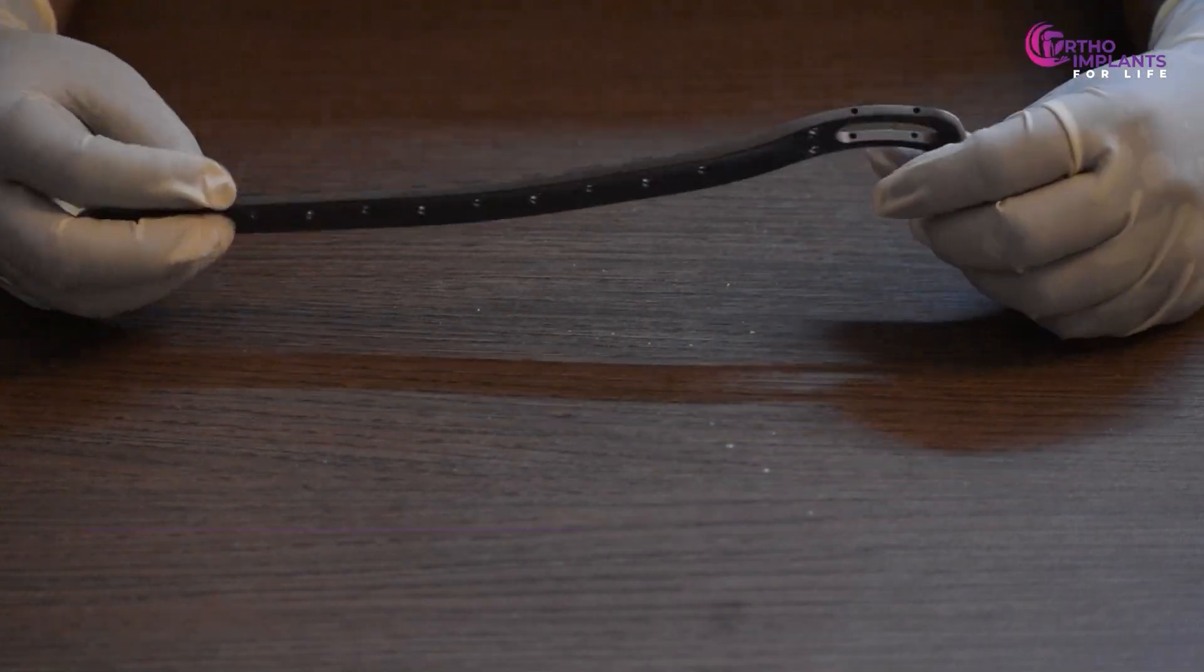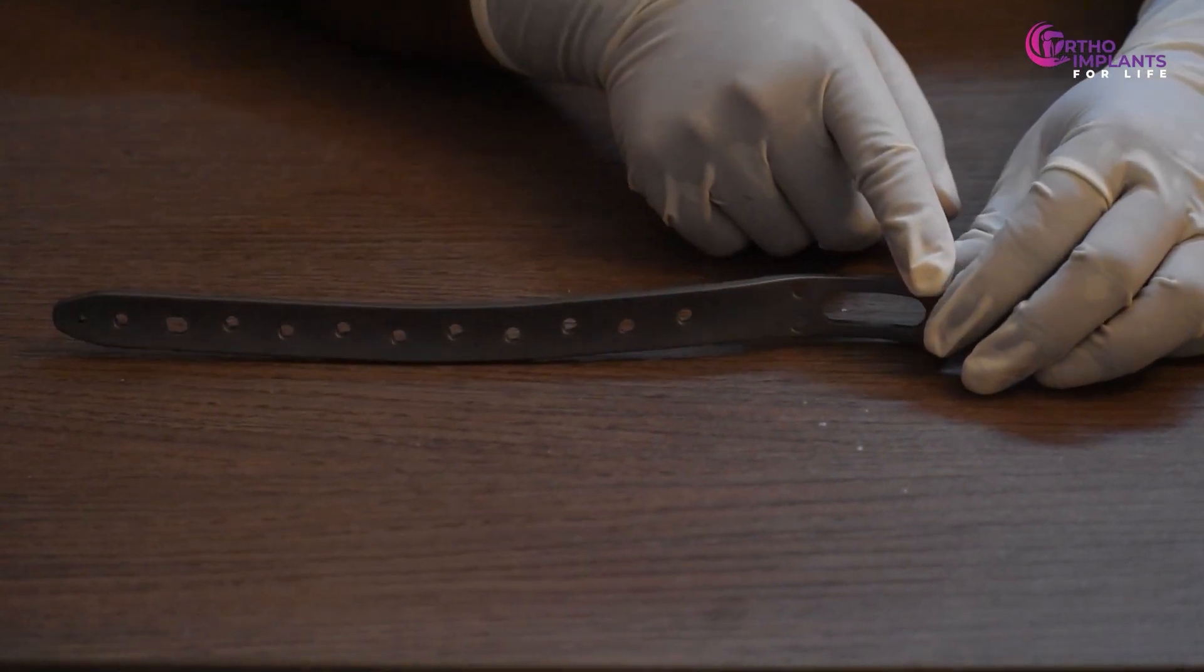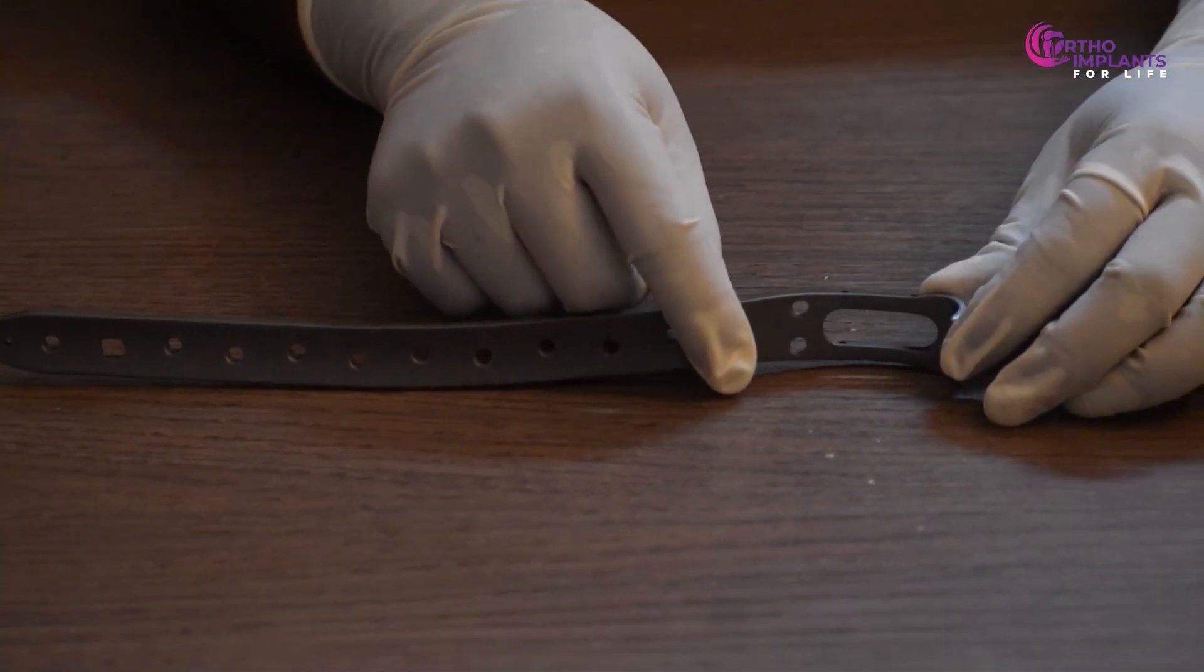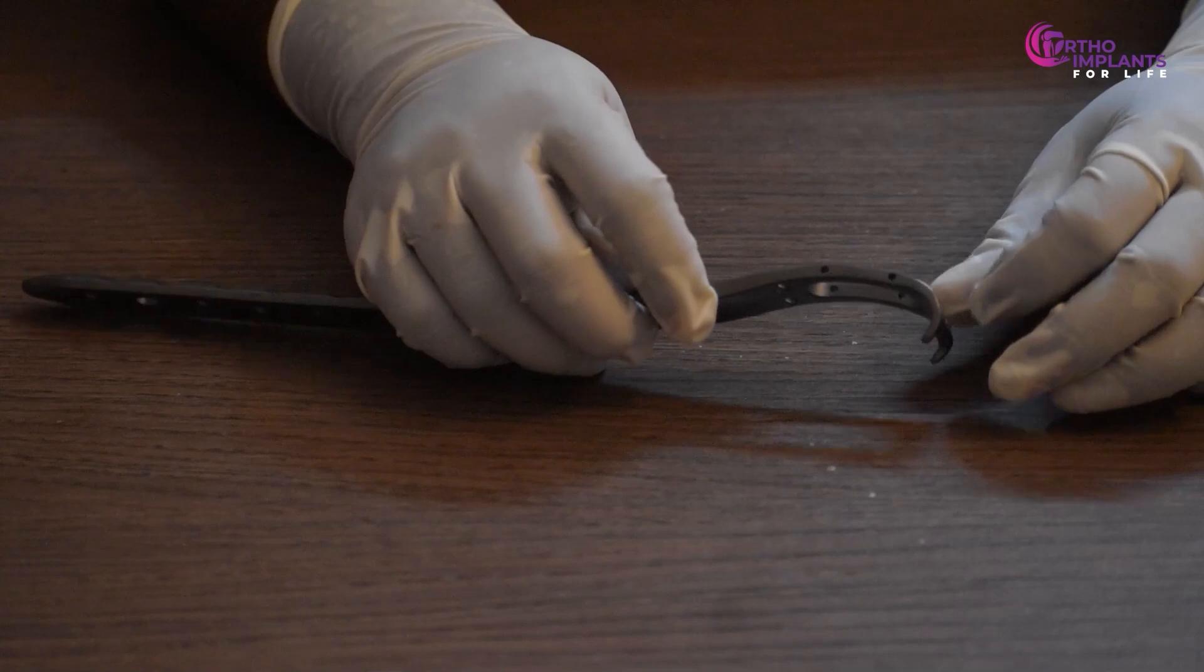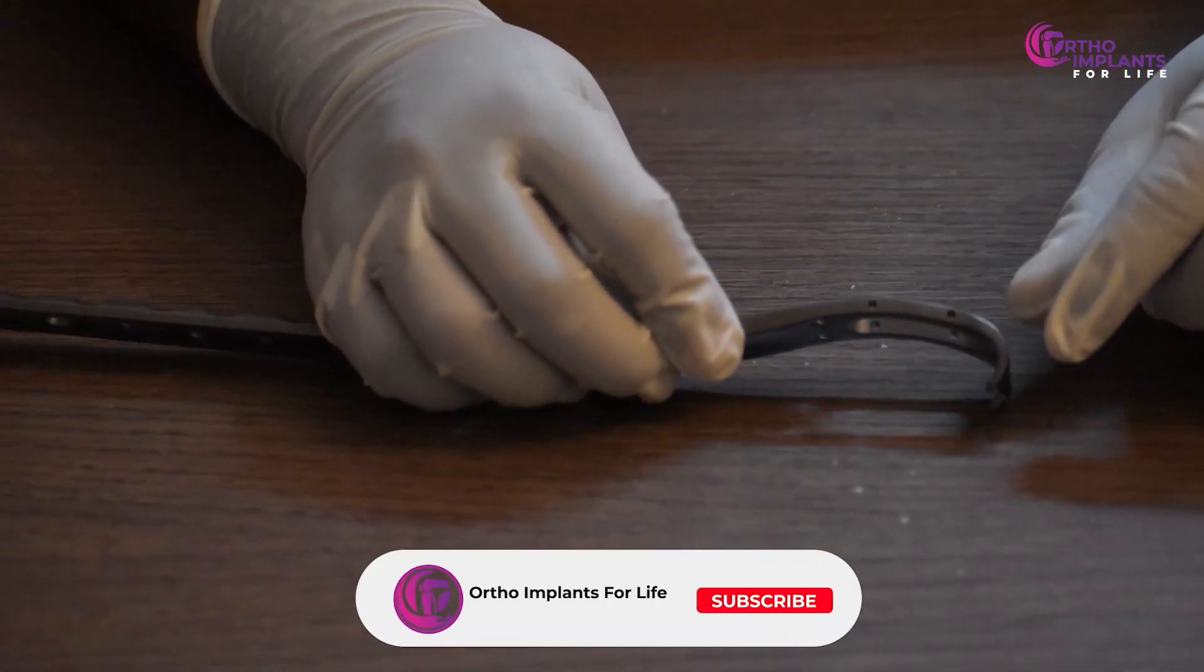The plate itself is called the periprosthetic plate. It's generally used for patients who have had a bipolar or prosthesis procedure. The upper two holes in the plate are for passing the cable.